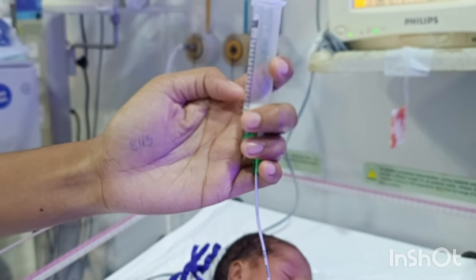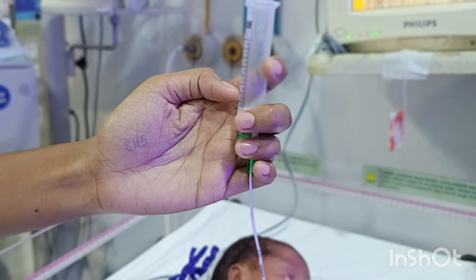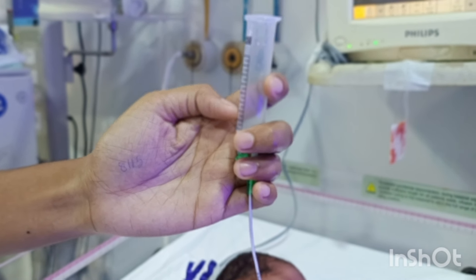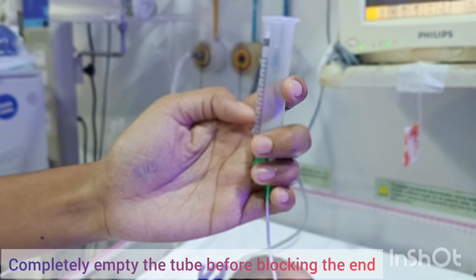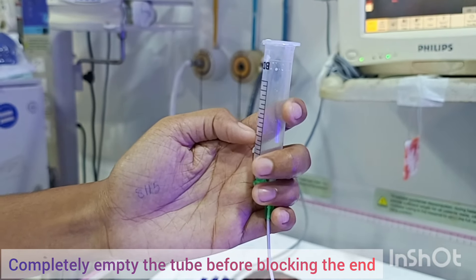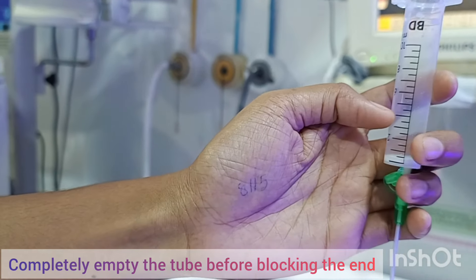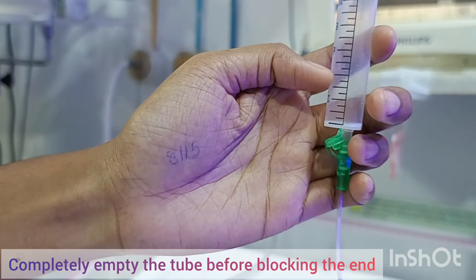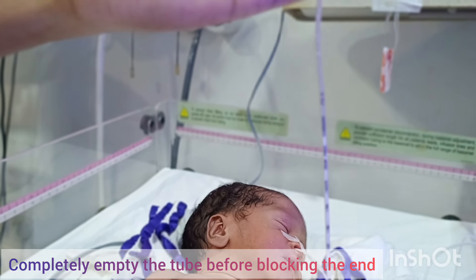Once the milk is all gone, we have to make sure that the tube is also empty and filled with air. If some milk stays inside the tube, it can decompose, and during the next feed it can go inside and cause infection to the baby. So we have to be sure the tube is completely free of milk and completely empty — that air is going inside before blocking the tube. The whole tube has to be filled with air.